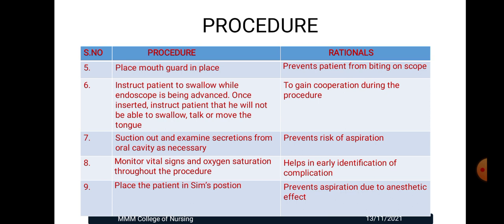Instruct patient to swallow while endoscope is being advanced. Once inserted, instruct patient that he will not be allowed to swallow, talk or move the tongue, to gain cooperation during the procedure. Suction out and examine secretions from oral cavity as necessary. It will prevent the risk of aspiration.